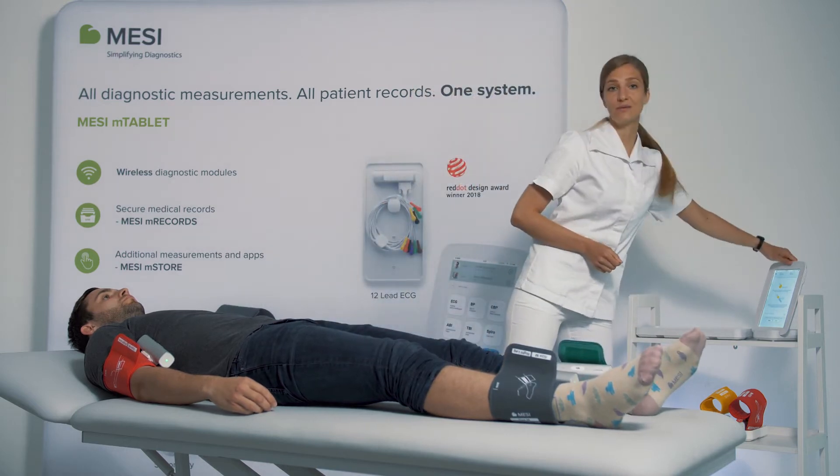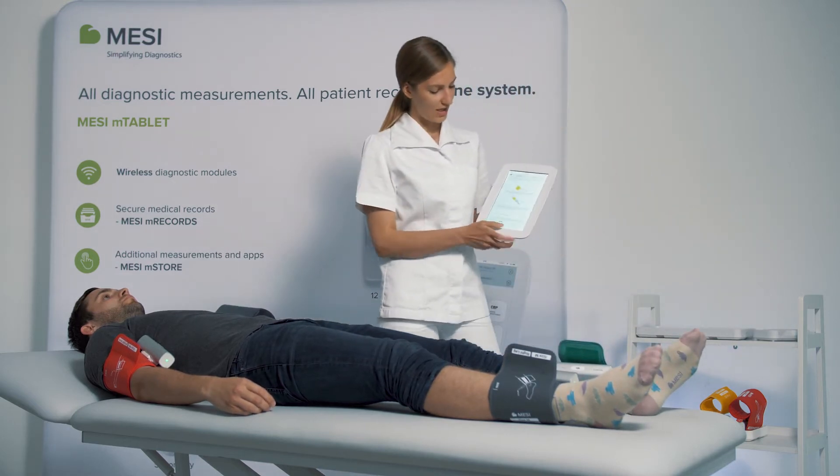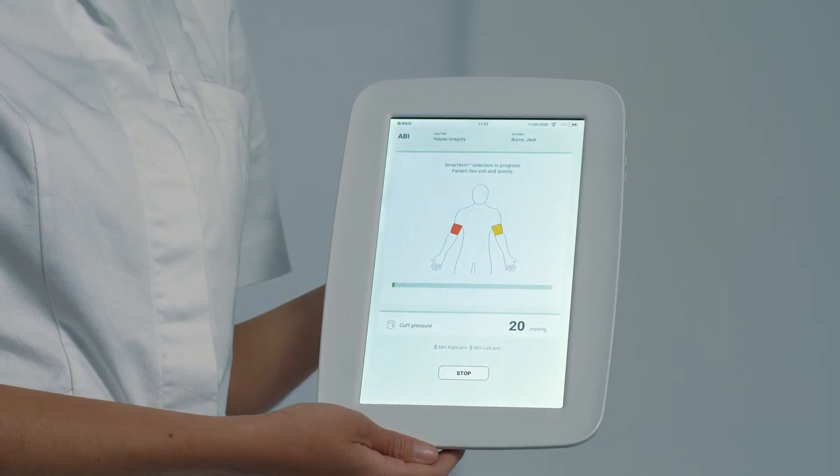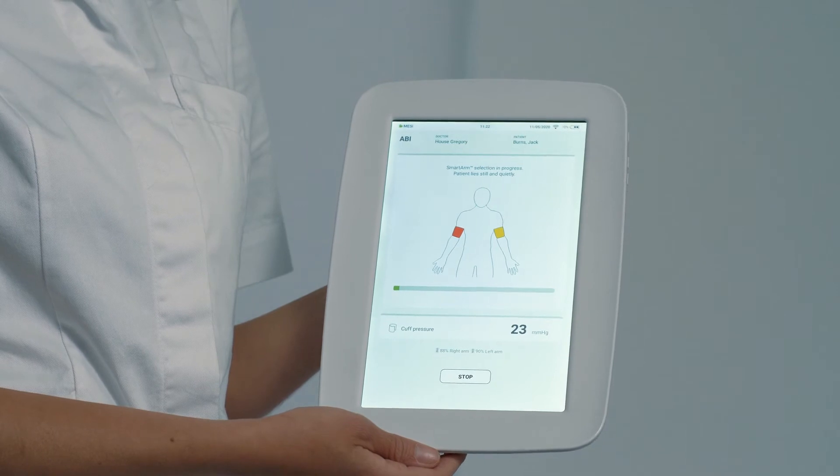Now we can start the measurement. After pressing the start button, the arm cuffs will start inflating first to determine the higher of the two arm blood pressures.